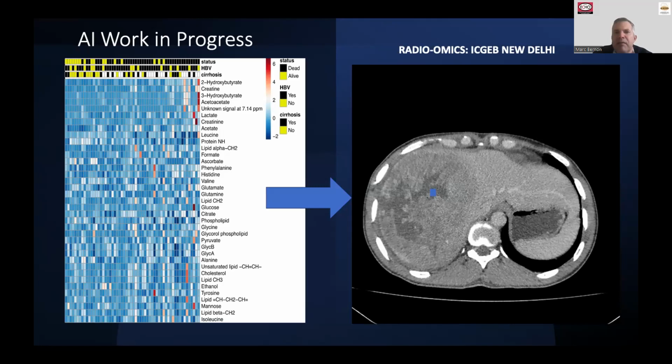Then, does the limitation of venous obstruction apply to portal thrombus caused by the tumor itself, or only obstruction caused by another reason? I think a portal vein thrombosis isn't a limitation. You can still use the LI-RADS system, and in that case you'd be dealing with a tumor in vein situation.